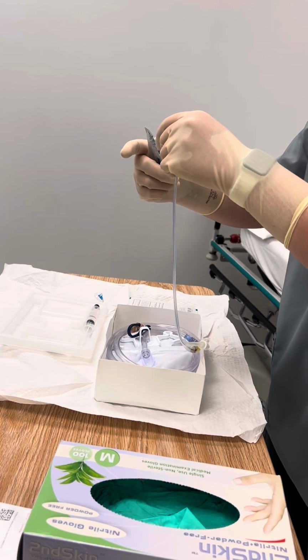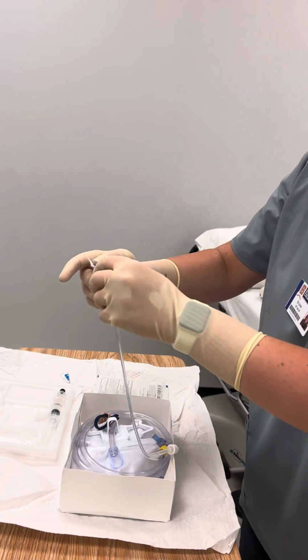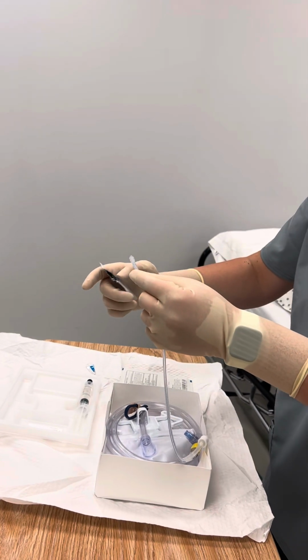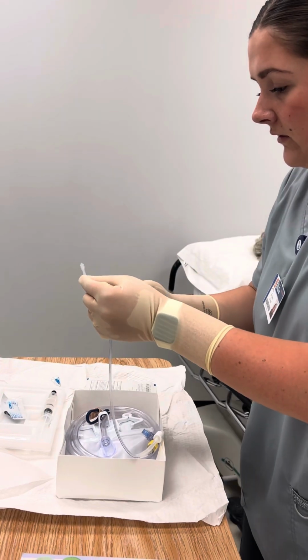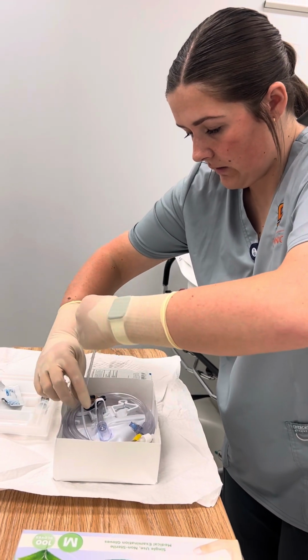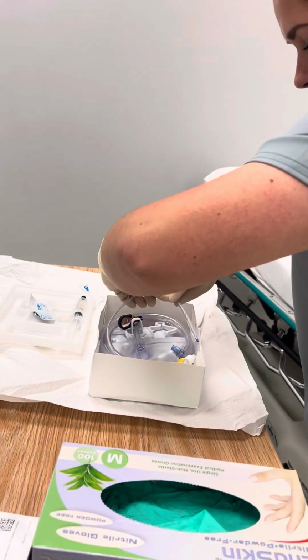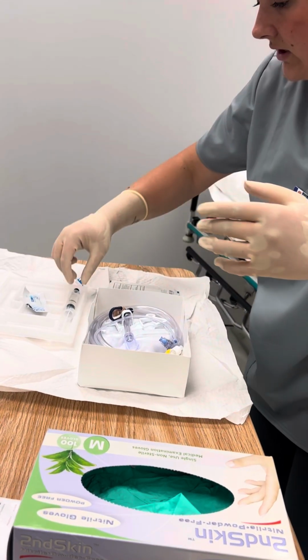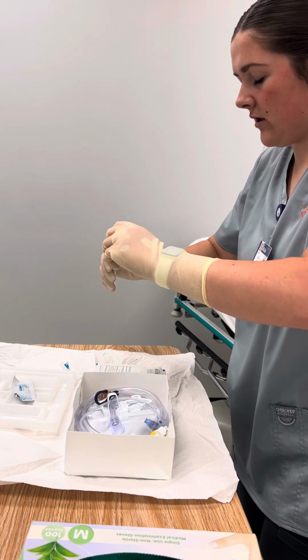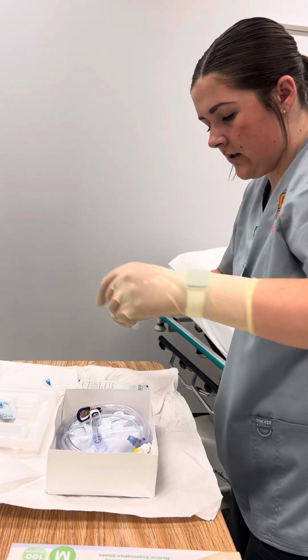And I'm going to lube 2 to 3 inches of my catheter. Okay, perfect. I'm just going to set that right back in there. Not touching the sides.